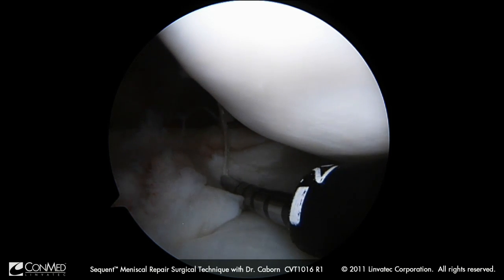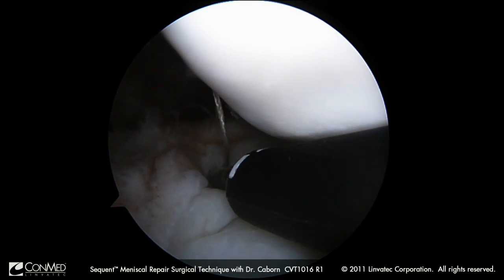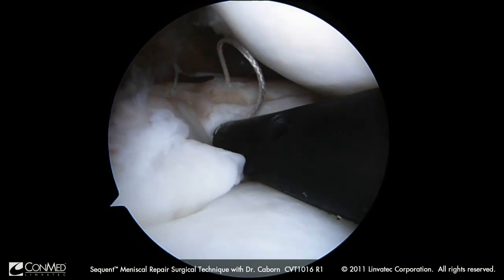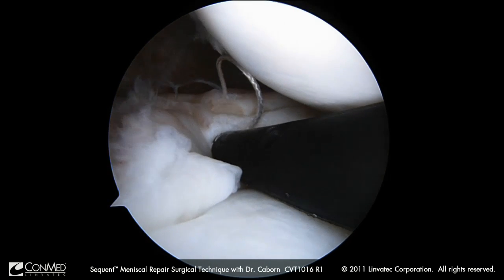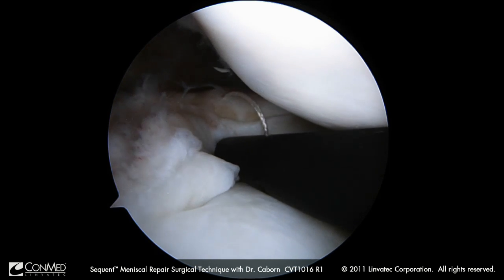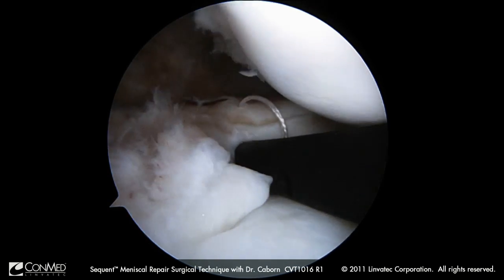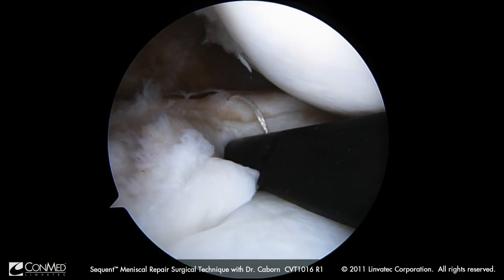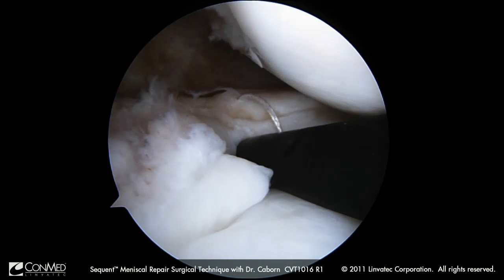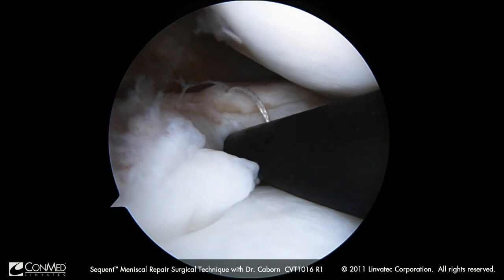I am still in freewheel mode, so nothing is locked in the system. I am going to go through the meniscus — we have gone through. You can see I have still got some slack in my suture, which is important. I am now going to rotate two revolutions, because that is going to allow me to lock the cleating system on the back. This is a linkage system, but each link has its own locking, so it is a very stable construct.